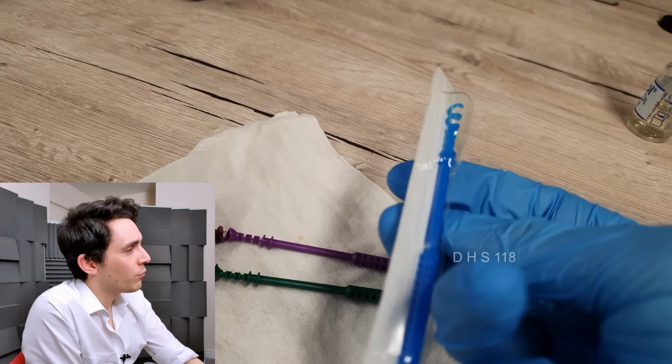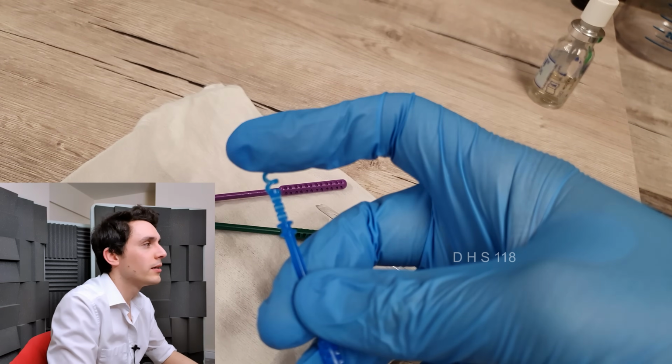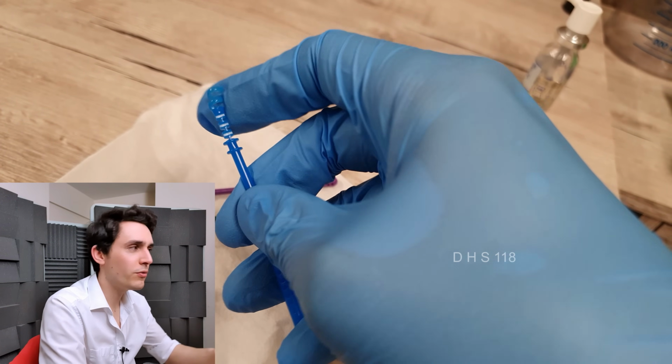So those are the two devices, and I'll show you the other one as well, the small blue one. What you'll see is it's actually fairly flexible and bendy and soft, which is what you want, because most ear canals do have a bend in some fashion, whether it's bending up or to the side and so on.